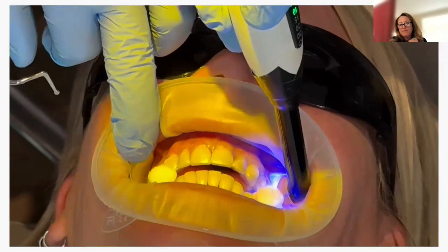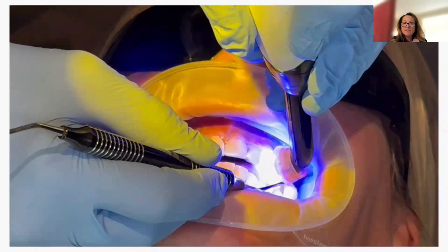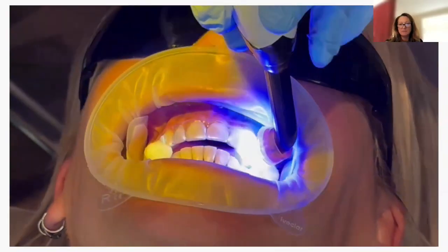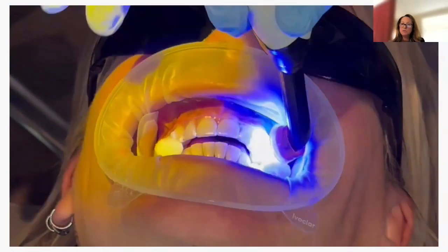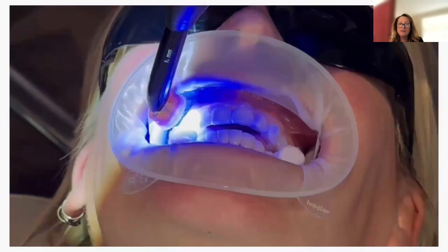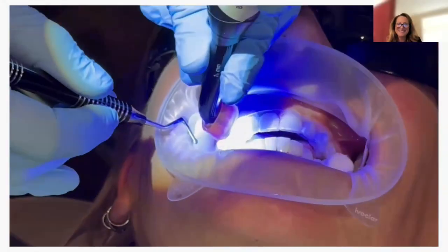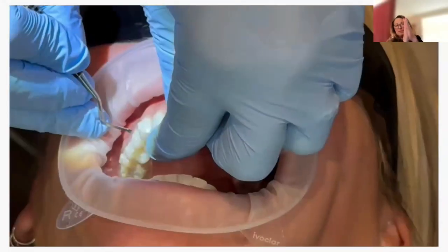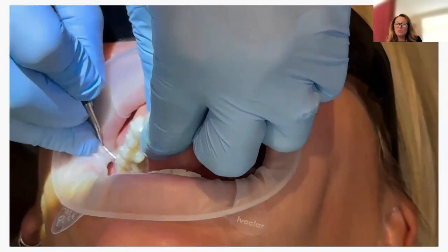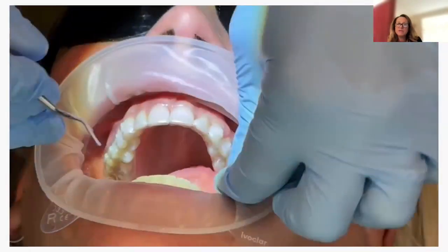And you'll see that the attachment stays inside the template because saliva got into that area. So then they had to re-etch and bond. So I'm going to pause this while I keep doing that. And then if you guys have any questions, you can ask, because we all know how to light cure. But me, like I said, I would be pressing that template down. You're going to, like, kind of work the template off to get it off of those attachments.